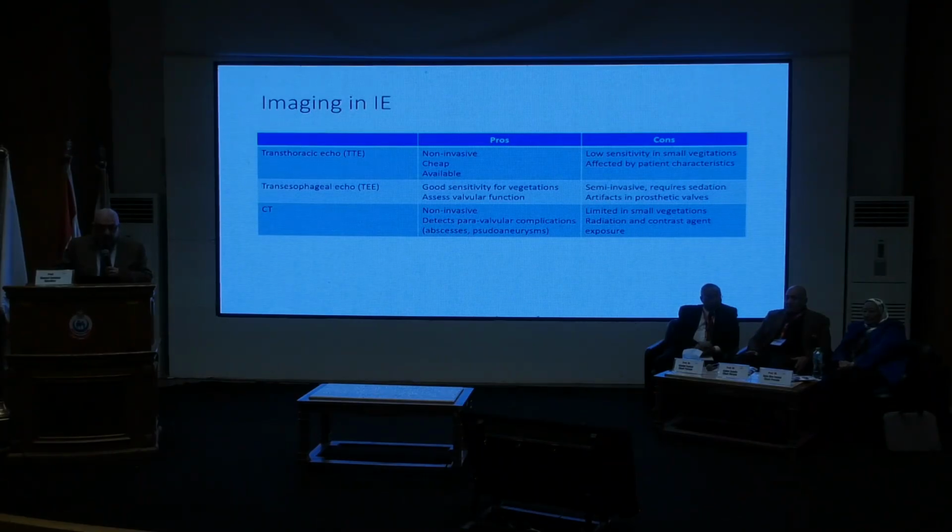And then we have CT. CT, of course, is non-invasive. It can detect the paravalvular complications that can occur, but it's not very sensitive for small vegetations. And of course, it has radiation exposure.